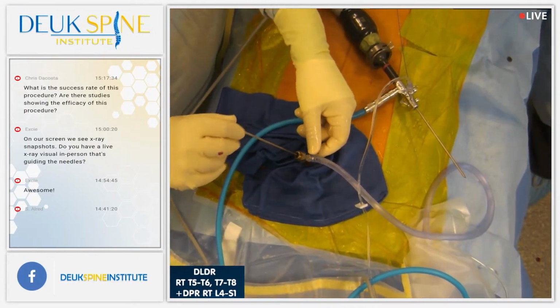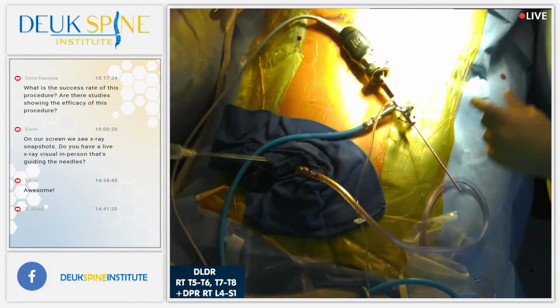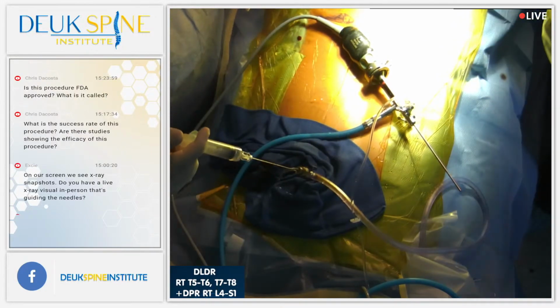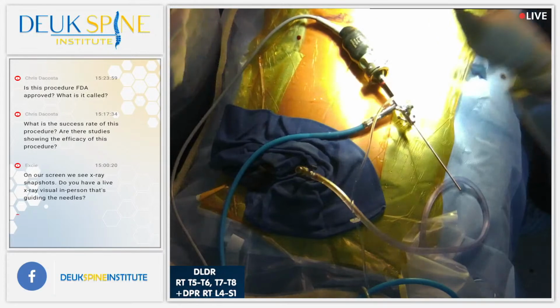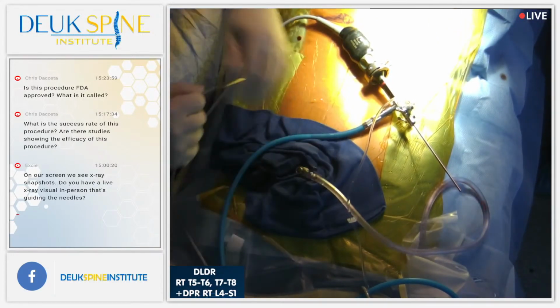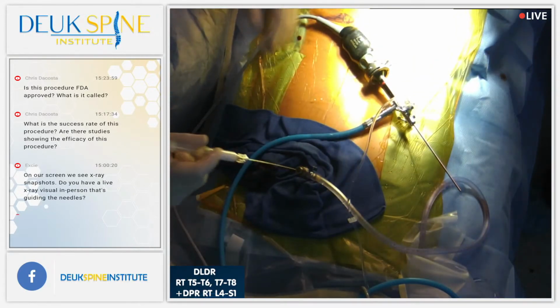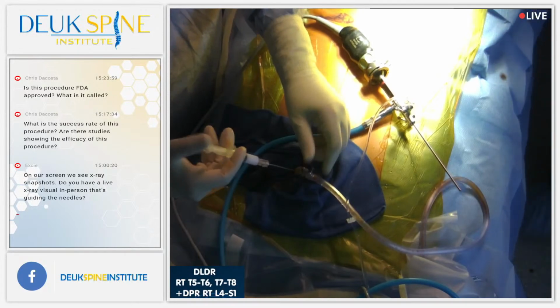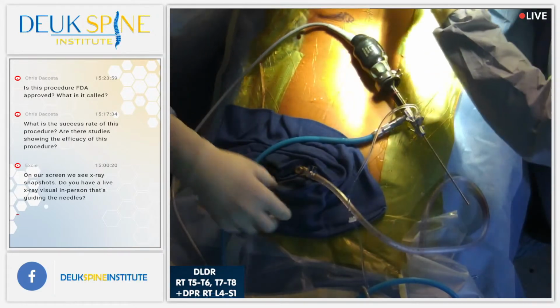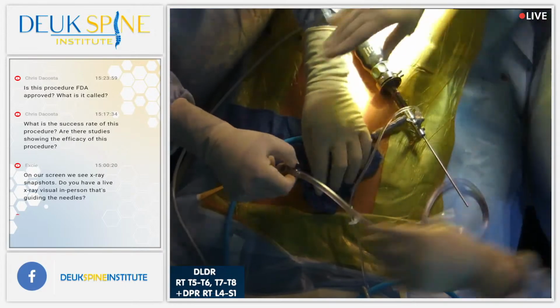She's got lower back pain over the facets at L4-5, L5-S1. So we're going to go in and we're going to deaden the pain nerves. The pain nerves to the facet joints are called the medial branch of the dorsal ramus. And what it is is a small nerve branch that comes off your nerve root as it exits the foramen. And it sends a nerve backwards towards the facet joint. And that's the nerve that all the pain management doctors are trying to treat by rhizotomy.